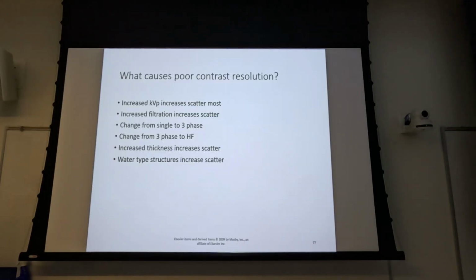If it increases penetration, it decreases differential absorption, and theoretically, because you penetrate more tissue types more evenly, then theoretically it could reduce your contrast. But how much? In a digital world, not that much, not that much.